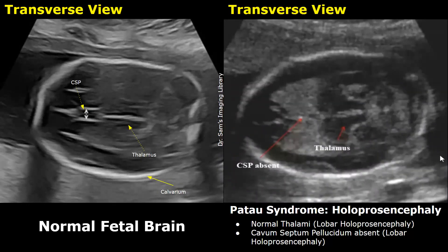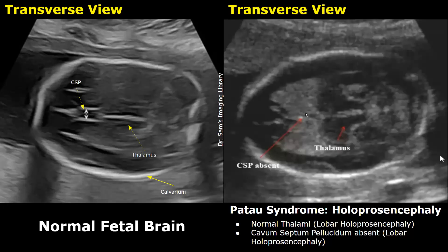The third type is lobar holoprosencephaly. It is the least severe type. The thalami will be normal in this type. The falx cerebri is present and the thalami are seen on either side of the falx in this image. But the cavum septum pellucidum is absent. The cavum septum pellucidum will normally appear as a hypoechoic or anechoic fluid-filled, somewhat rectangular-shaped structure anterior to the thalami. But in this image it is absent — we do not see a hypoechoic fluid-filled structure anterior to the thalami.